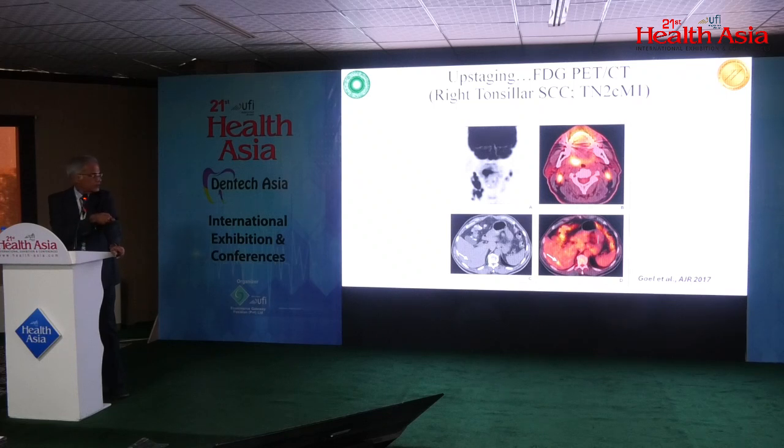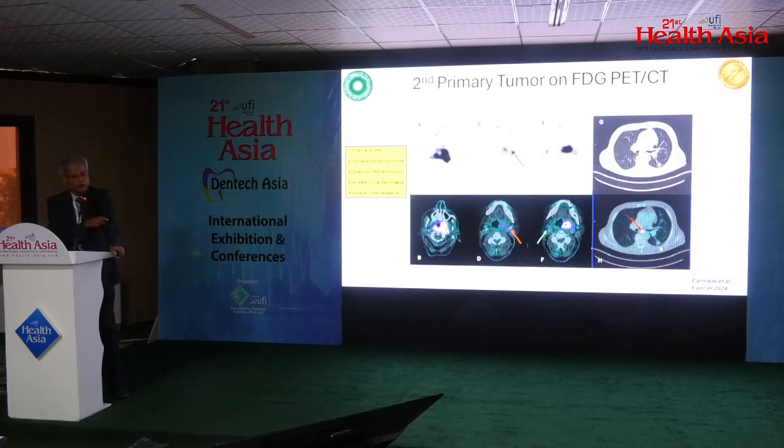This is another example, right tonsillar squamous cell carcinoma. The patient has a right tonsillar hypermetabolic lesion and bilateral hypermetabolic nodal disease, but on CT there is a small hypodense area which is showing abnormal metabolic activity, and the biopsy turned out to be squamous cell carcinoma metastasis. So again, this patient was stage 2, upstaged to stage 4.